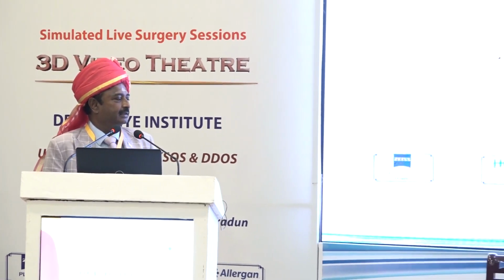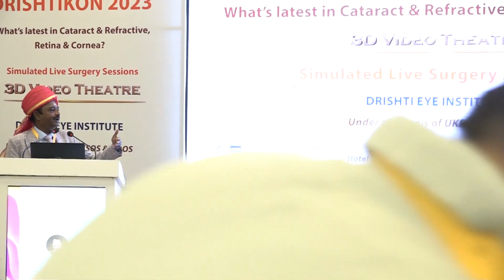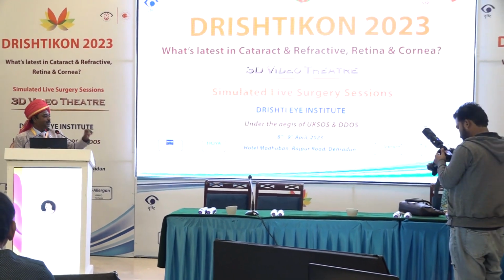And for the first patient that you showed, you didn't buckle, you made a scleral flap for drainage. Yes, I always do a scleral flap. Do you routinely do that, or just do a drainage point through a needle? No, because with needle people have reported hemorrhage. Even I have tried, and it's a blind procedure. Even though you can do it after making a scleral cut down with a needle? Because I learned when I was doing the scleral implant, I found it was easy to make a drainage site and then do the drainage.